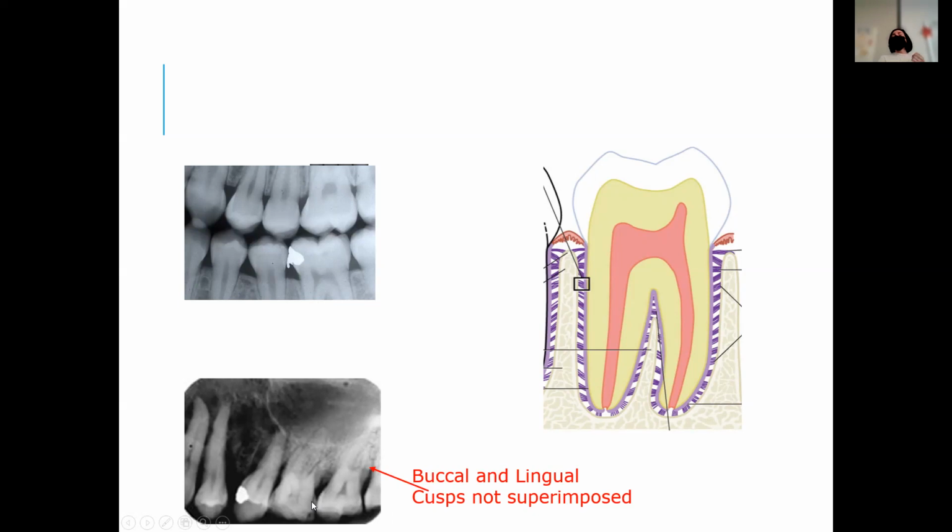It's hard because you can have vertical angulation on a couple teeth in a picture, but not all of them. So when I'm grading the vertical angulation, I kind of grade a little bit easy, because if every single one has vertical angulation, and the roots look really short and you see a ton of occlusal surface, then that's more obvious. But with something like this, you might go, well, these teeth look okay. The cusps are pretty close together, but this one has quite a fair amount of distortion, and it's also at a different angle. But yeah, that's what this is trying to point out, the difference between the way this image looks and the way these look up here.